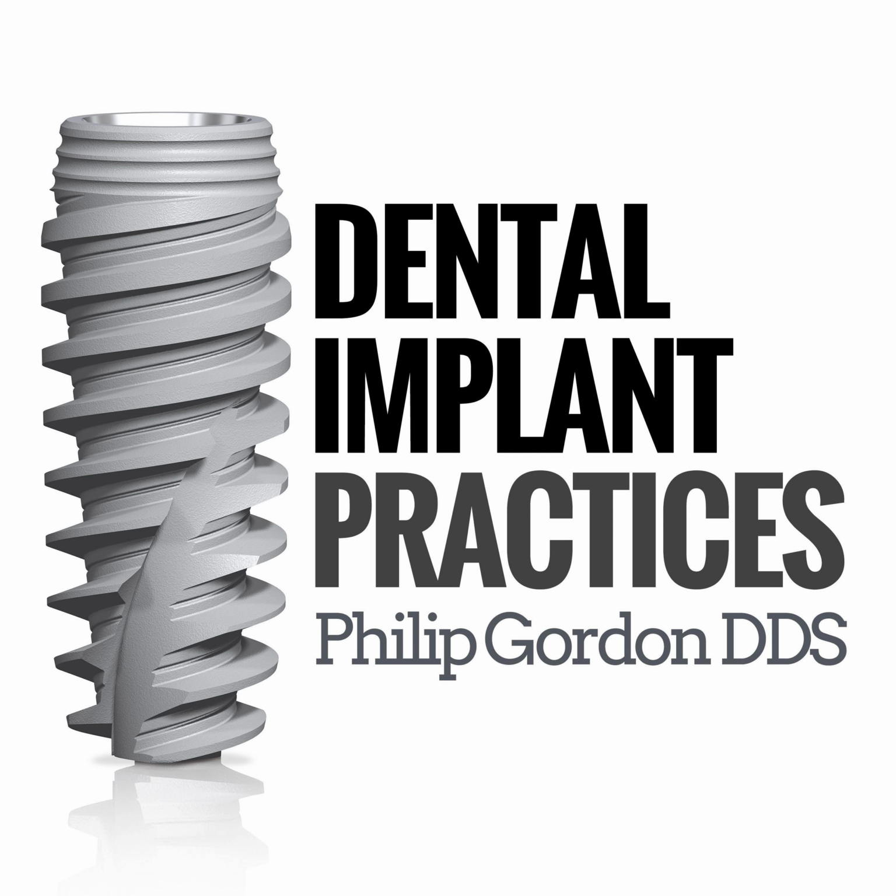Perfect. So you send the guide, and it comes with the clear version of the prosthesis. It comes on a bite registration, so the patient bites into that. I place my pin guides, fix that in there, remove the prosthesis, level the bone, snap on my surgical delivery portion for the implants, place the implants, and set them with timings based on indicators on the guide. Then we're ready to move on to the next phase, which is the pre-made temporary prosthesis. Is that right?